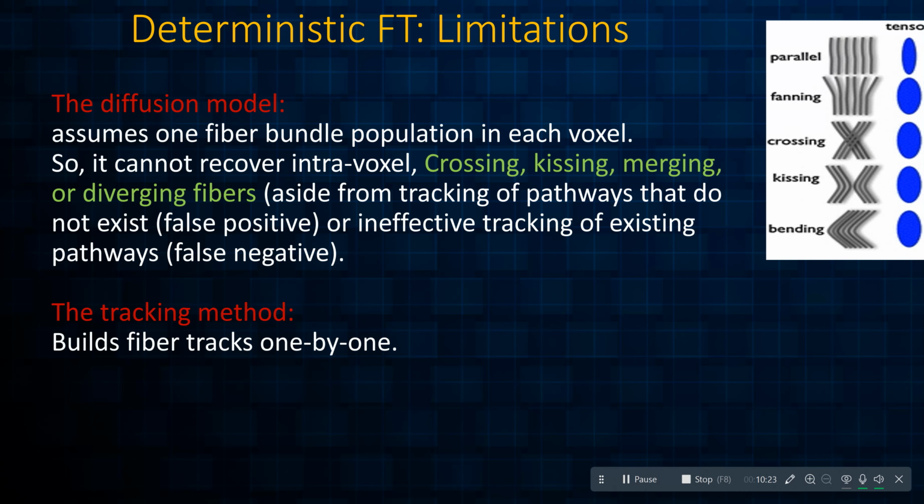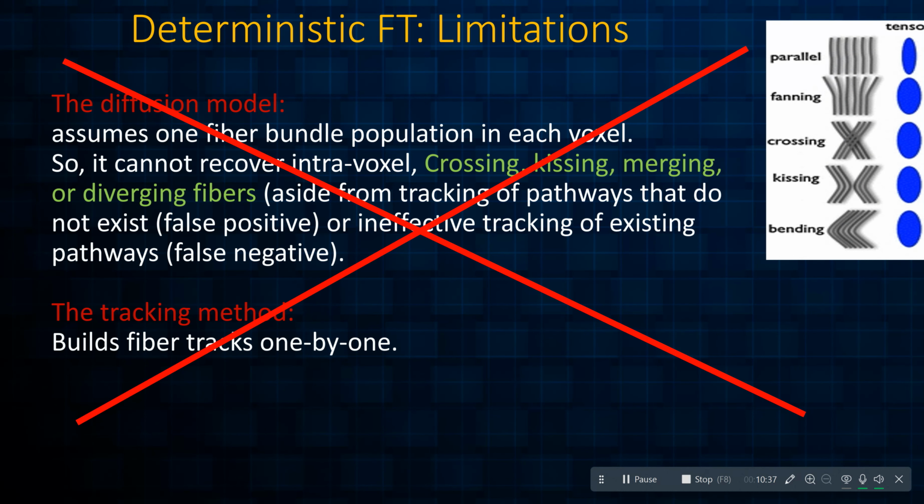Because it's based on a simple Gaussian model, it doesn't account for any crossing. And the problem we have within the external anal sphincter in the perineal body is that the muscle fibers might be crossing. So we could not use this kind of method, as it would give us erroneous results within the external anal sphincter.